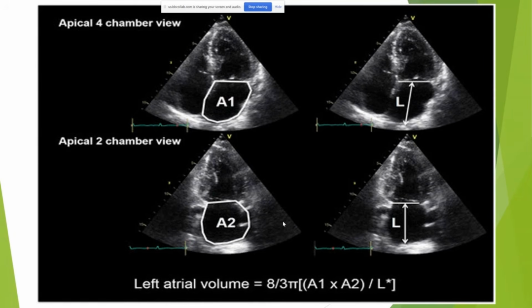You need to remember these measurements have to be at the right time during the cardiac cycle. Whenever we measure the left atrium, it should be measured at end ventricular systole. So the ventricles are going to be the smallest, which means the atria are going to be the largest. We always want to make sure we're avoiding foreshortening by moving down one intercostal space until it appears oblong and not rounded. So this trace that we're doing, what we call it in echo is planimetry.